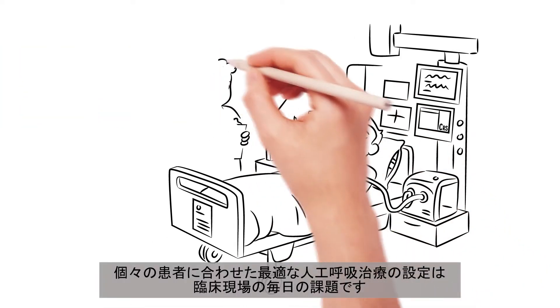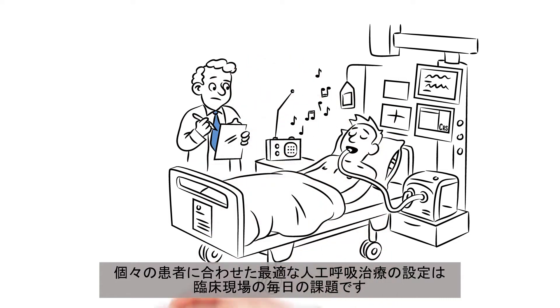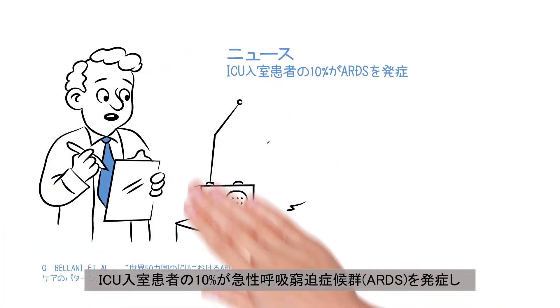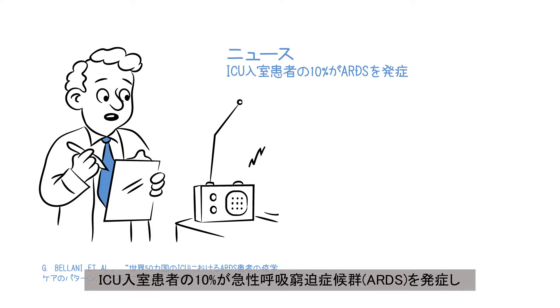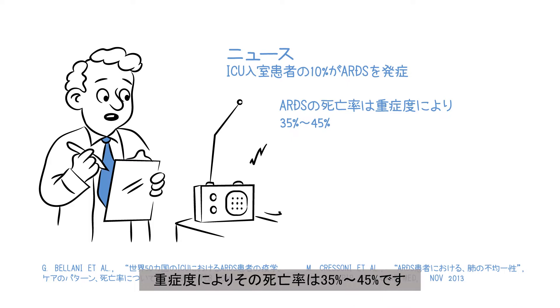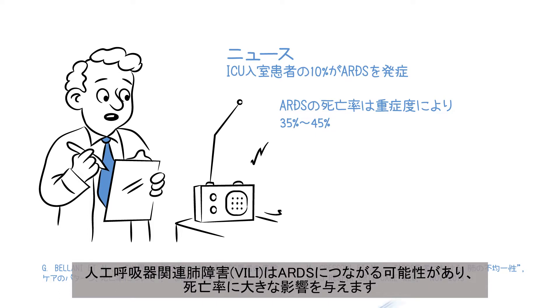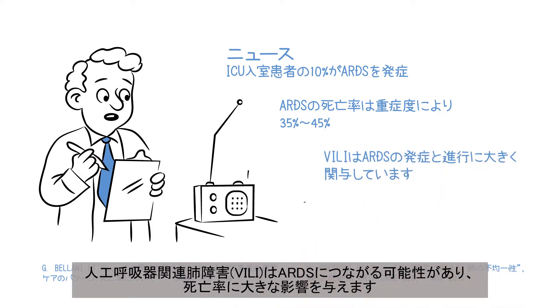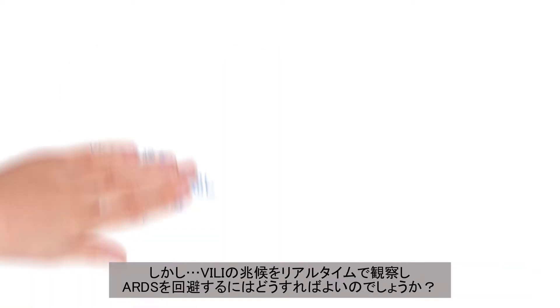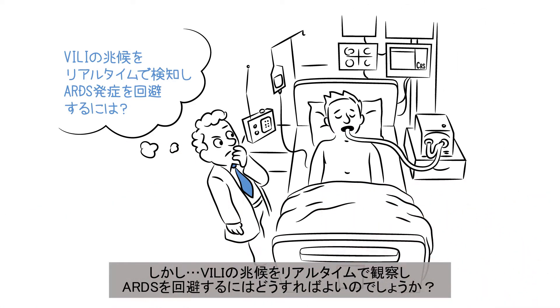Finding the right respiratory therapy for your patient is a daily challenge in your clinical routine. 10% of all admitted ICU patients develop acute respiratory distress syndrome. Their mortality, depending on the severity of ARDS, is between 35 and 45%. Ventilator-induced lung injury has a major impact on patient mortality and can lead to ARDS. But how can we see signs of VILI in real time and maybe avoid ARDS?